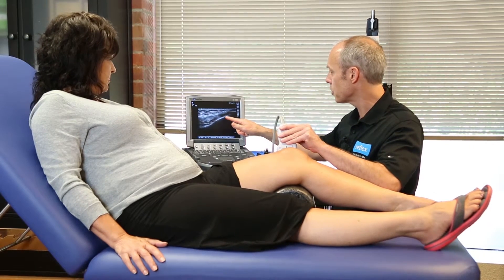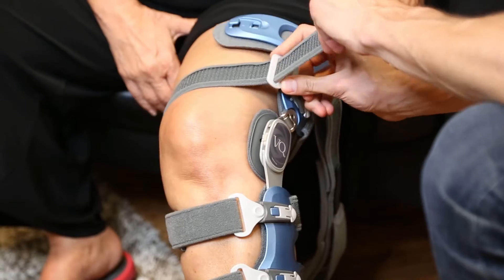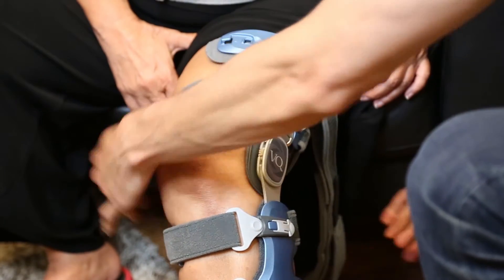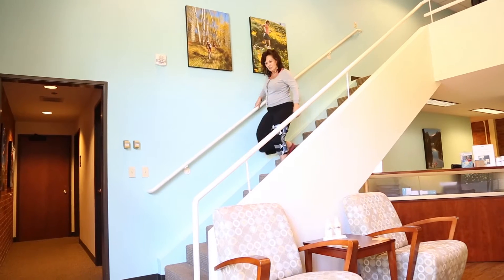When medically necessary, Reflex physicians may recommend an offloading knee brace to provide joint support and to reduce pain. This lightweight device promotes proper gait mechanics.